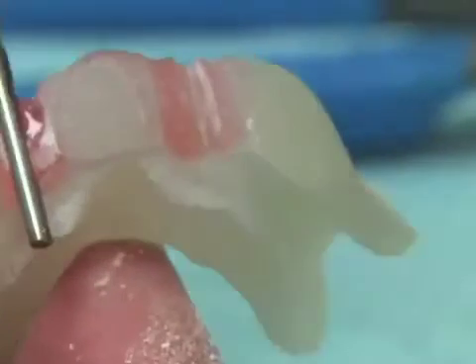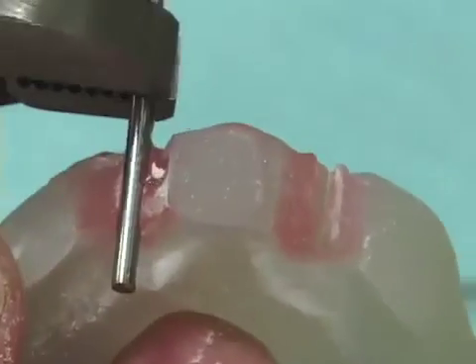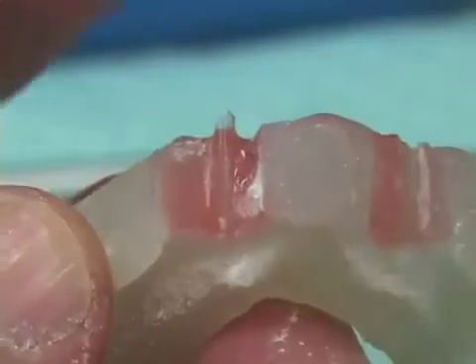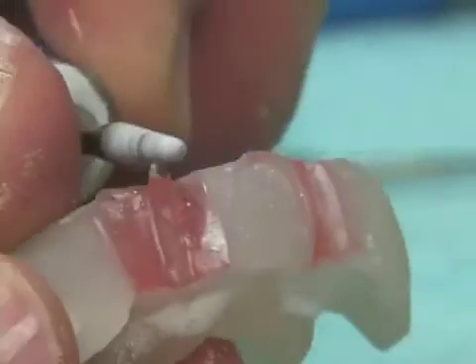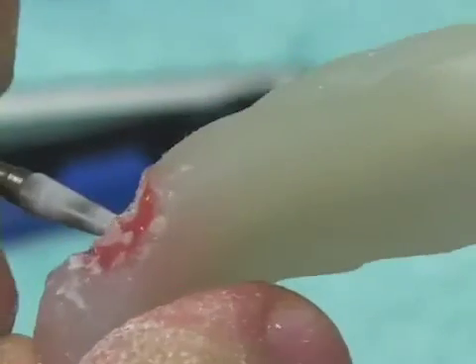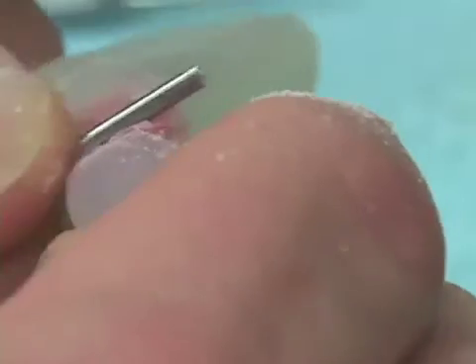So I've cured that extra material that I added around part of the drill blank here. And so again, I can use pliers if necessary to free that up and lift it up. So now I have a better surrounding of the lingual 180 degrees of the drill blank. I come right back and just trim the excess material. And then make sure that my drill blank can thread up from the bottom very nicely.